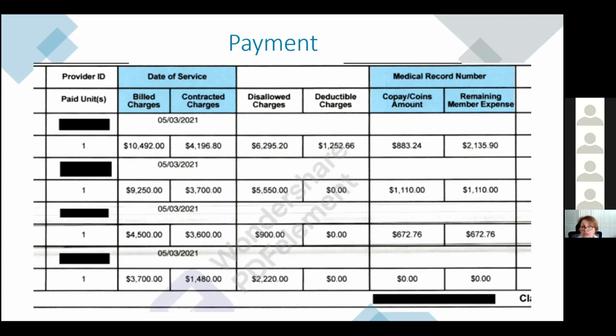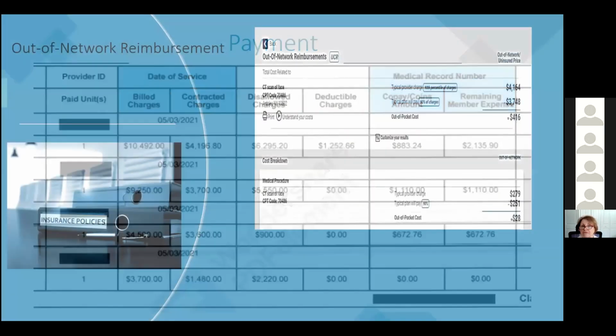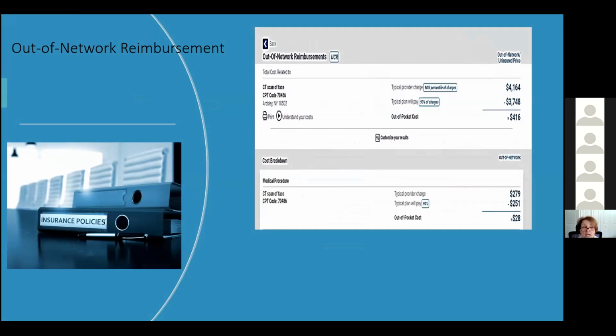So you're looking at implants, bone grafting, surgical extractions, and some other treatments, and you have the ability to do that. But you really can't document a lot of it, medical necessity, unless you have information that gives you medical necessity.